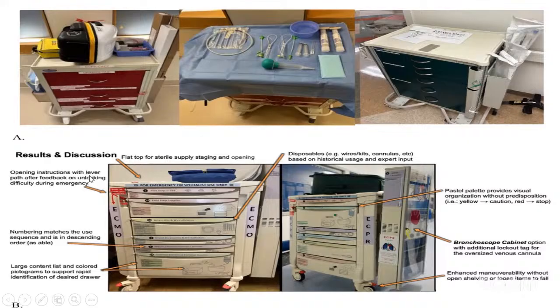So opening instructions are given. Then you have the numbering that matches with this. In some of the ECMO trolleys, they have already given cannulator 1, cannulator 2. So everybody has to open that one particular compartment and take those things, and the time and confusion are saved at that point of time. It is color coded. It can be easily identified, and you can use the things properly.